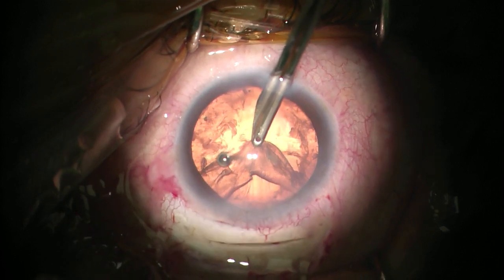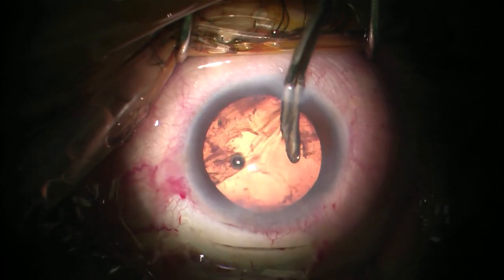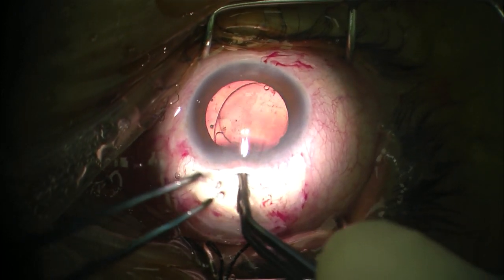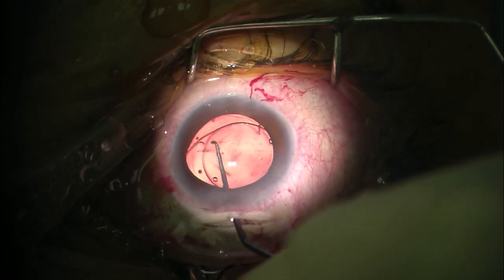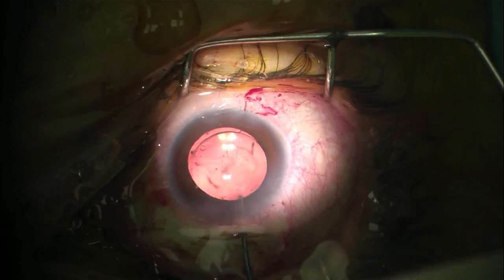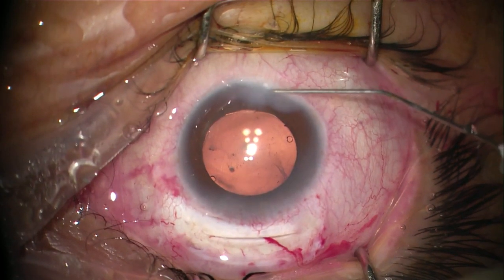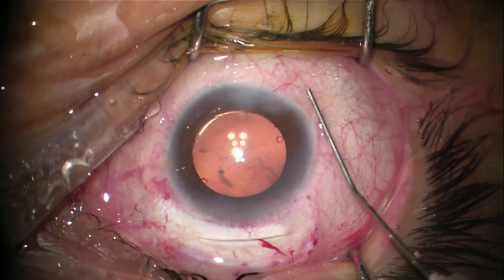Removal of the cortex is done through the side port. Notice that the anterior chamber is formed deep and the tunnel is self-sealed. You can implant any type of intraocular lens — here I implanted a 6.5mm PMMA lens inside the capsular bag. Viscoelastic is removed from the anterior chamber, then the side port is hydrated, making sure that the AC is formed and that the wound is checked to confirm there is no leakage.